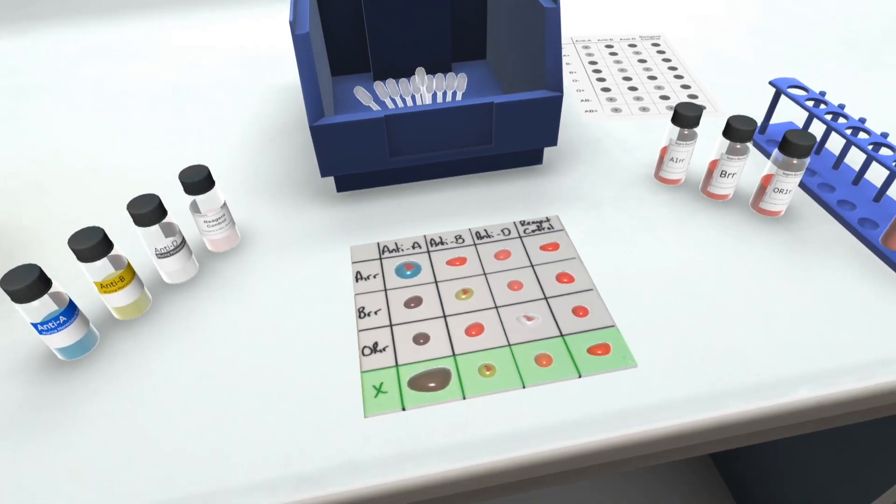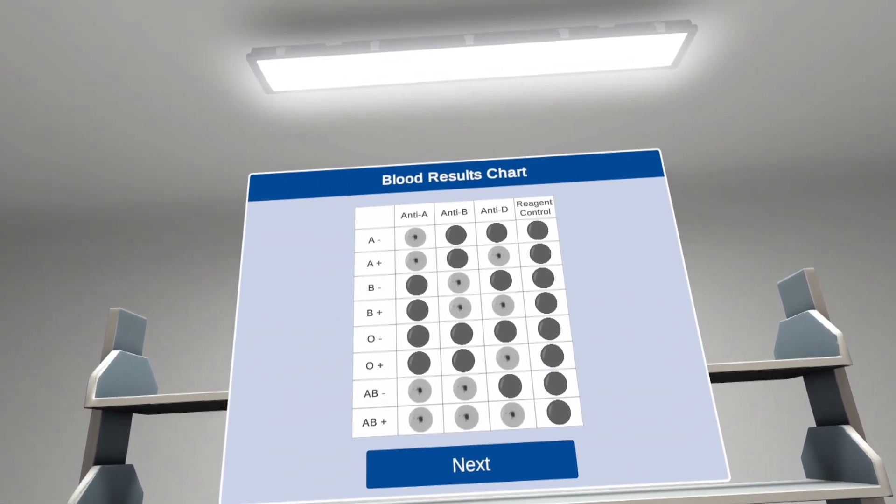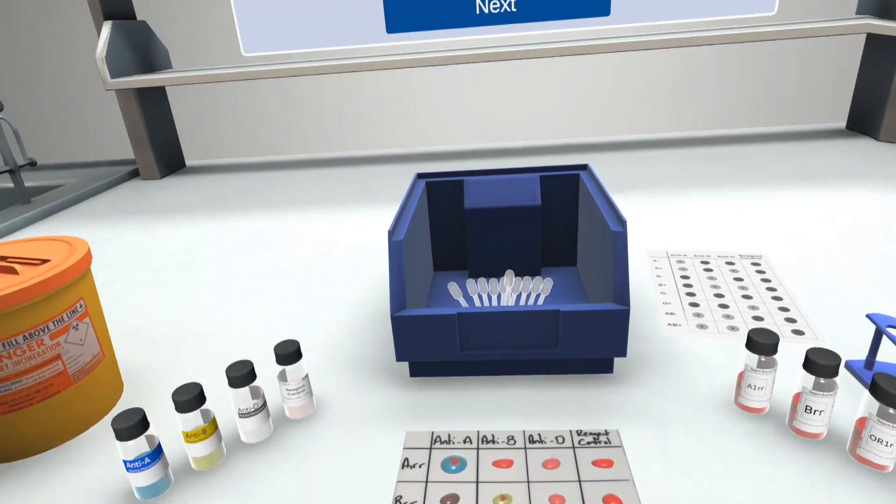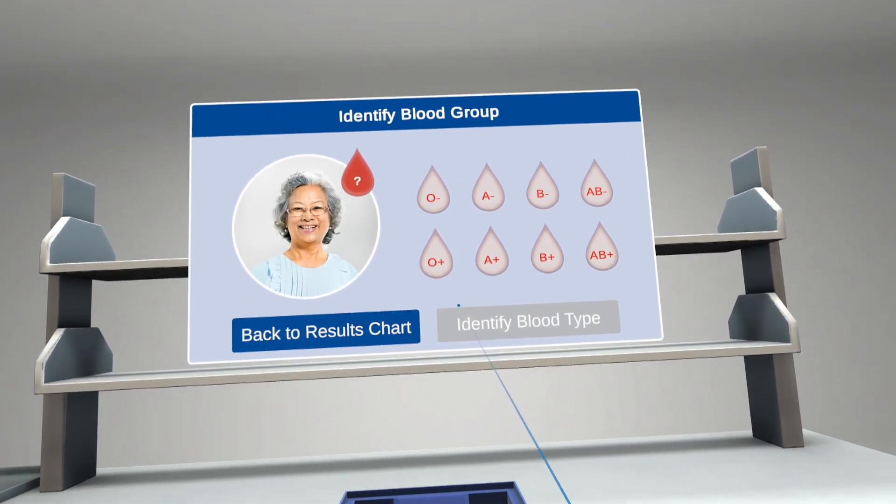The results are in. Consult the blood results chart to help interpret your findings. Compare the bottom row of your tile with each row of the chart and look for a match. Select the blood type that corresponds with your choice.